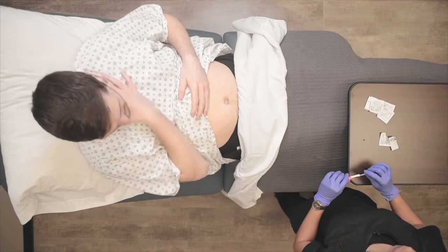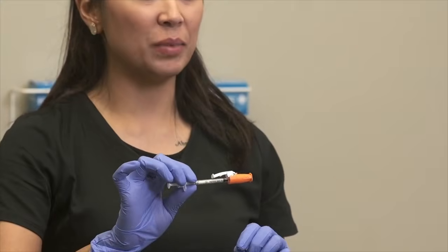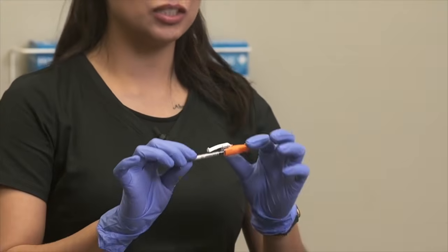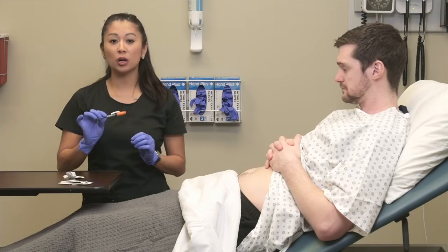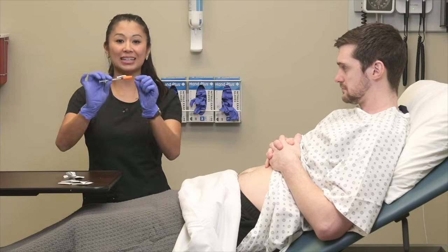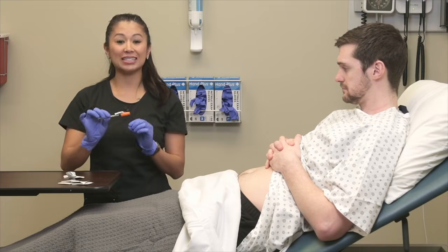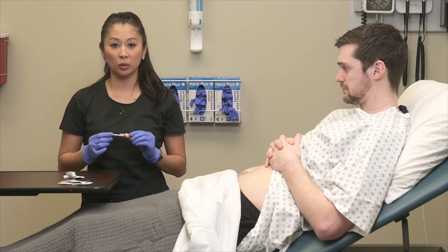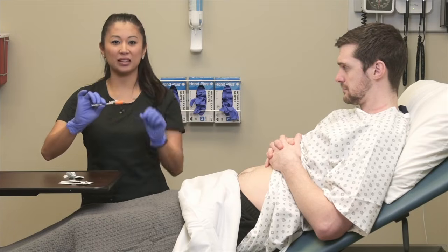Alright, so now let's get ready for administration. Now this particular syringe I have in my hand, notice the orange cap. The great thing about this is it's universal for the sign that it's an insulin syringe. So you should only have insulin in an insulin syringe. It's a little bit different for the fact that this is counted in units when you give insulin. So again, it's really important to pick the appropriate syringe for the right medication. Alright, so notice that orange cap, think insulin.